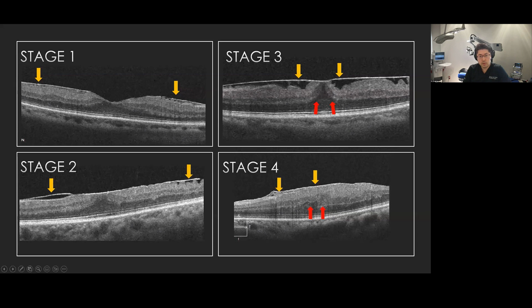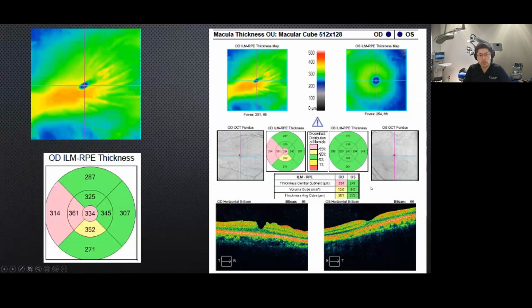However, for surgical retina in the treatment of epiretinal membrane, I still base it more on patient symptoms. However, outcomes have been shown in previous studies for stage 2 to stage 3. Beyond stage 3 to stage 4, the outcome is less favorable than those with earlier staging because of this disruption and the changing architecture of the retinal surface throughout the retinal structure.